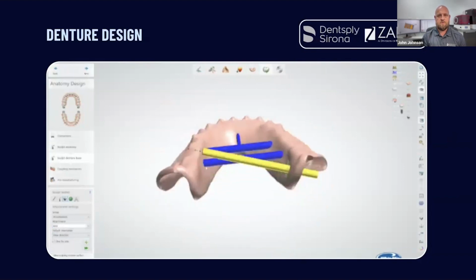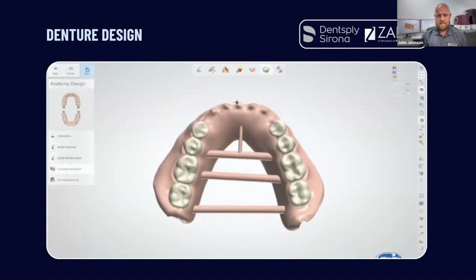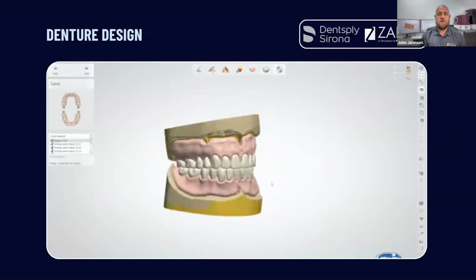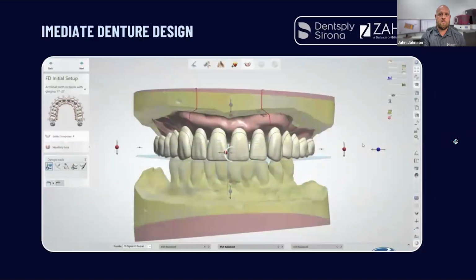It'll give you the two STLs that would be your bases, which would be basically like this lower with the sockets. And it'll give you all the individual quadrants that you would like. And like I said, you can utilize that however you want to within your laboratory. You can print single teeth, you can print full arches, you can print half arches.